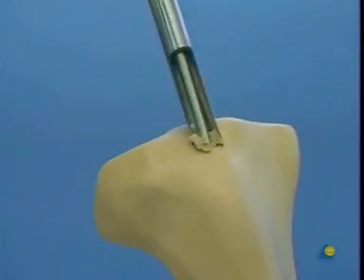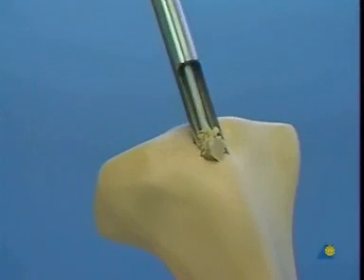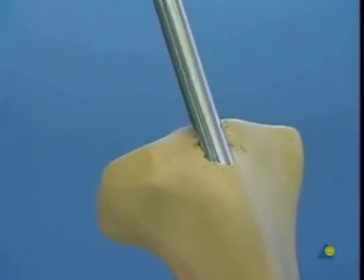Opening the cortex must be carried out carefully. It is more difficult on an artificial than a human bone. Once the medulla has been reached with the cannulated cutter, it is withdrawn.